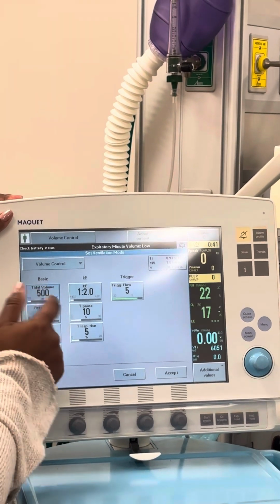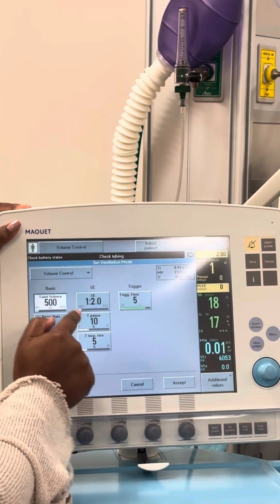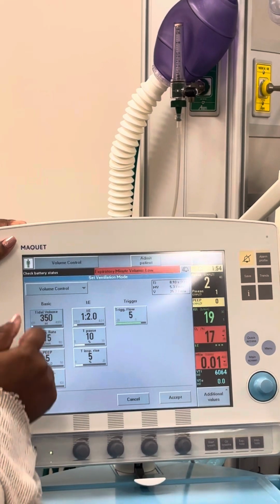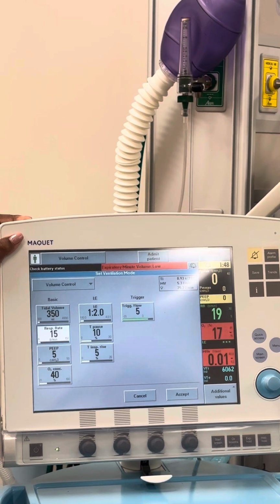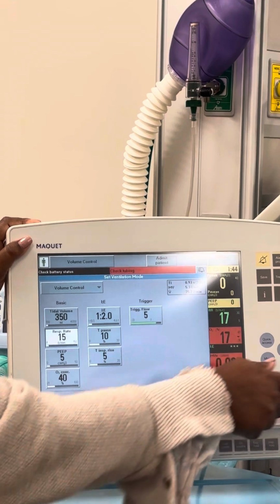I can hit the button here, hit the button here, and then I'm going to turn this blue knob over here. All right? And I'm just going to hit it back. Okay? I'm going to go down. I'm just going to do top to bottom. What's my respiratory rate range? What are y'all going to choose? Give me one. 12. Okay.